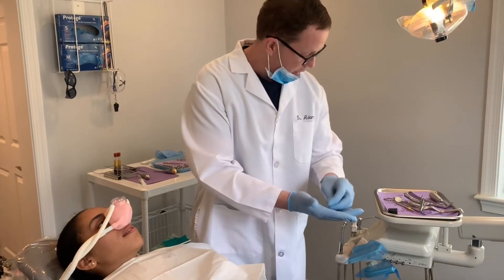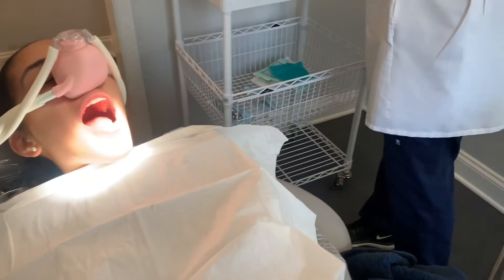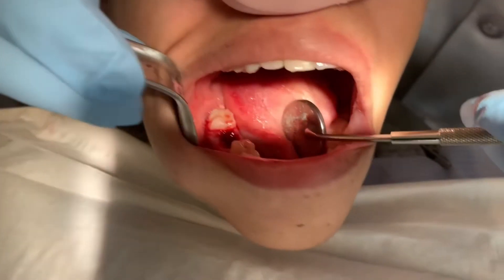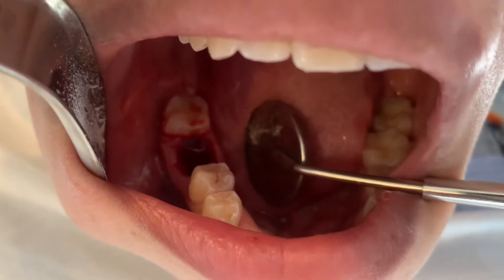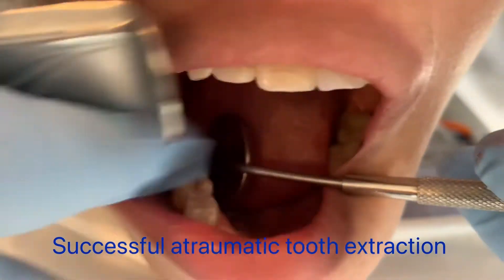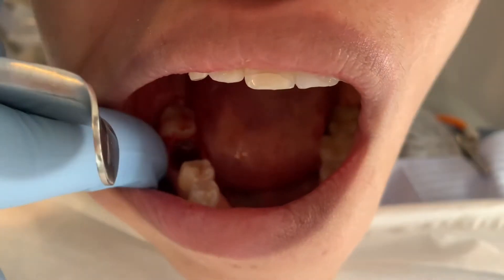Now we're at the point where we get to the most important part. Let's take a look at the tooth site. You can see that really not much collateral damage has occurred to the extraction site — we have gum tissue that has been relatively unaltered, and neither one of the next-door teeth have been damaged. I can put my finger in here and feel that the bone on the front and the back are very much intact. This is really exactly the way you want things to be.